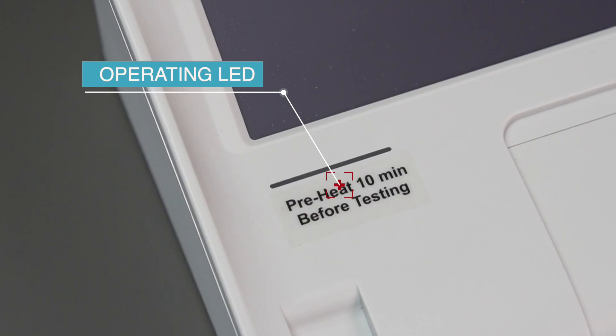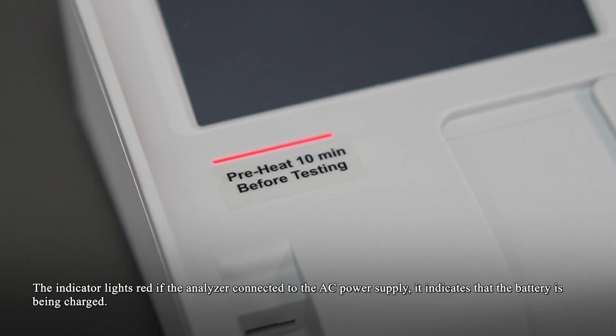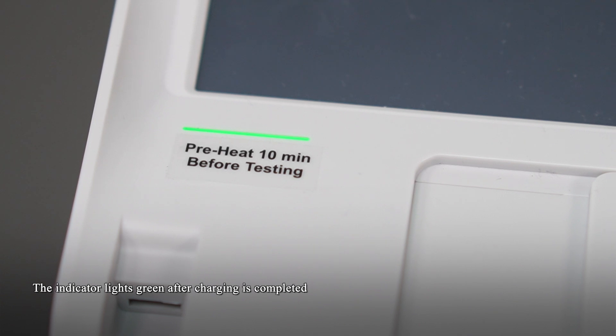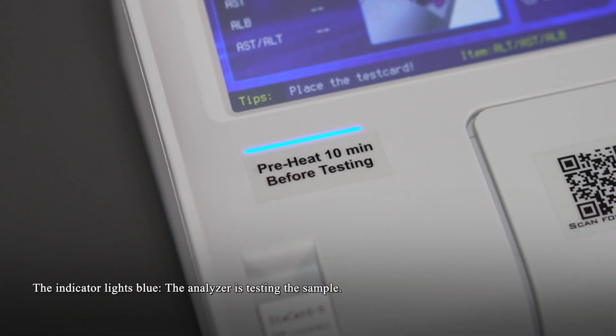Operating LED: The indicator lights red if the analyzer is connected to the AC power supply, indicating that the battery is being charged. The indicator lights green after charging is completed. The indicator is off when the analyzer is not connected to AC power. The indicator lights blue when the analyzer is testing a sample.